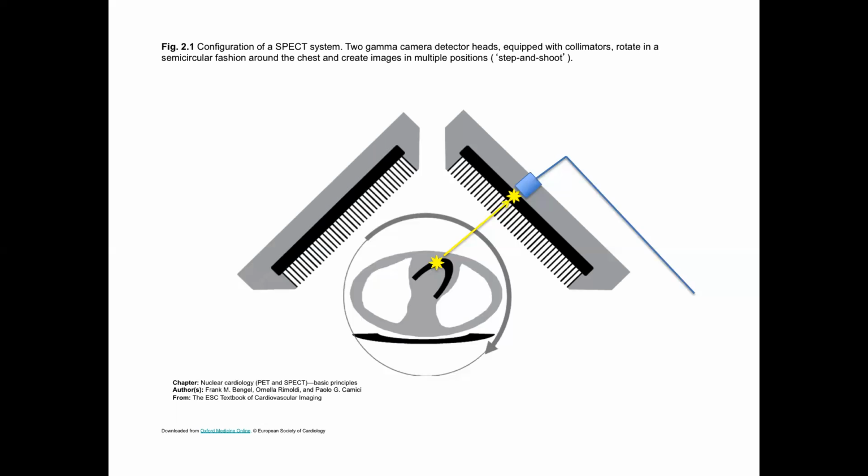For traditional SPECT systems that have sodium iodide crystals here, it takes about 20 minutes to collect all the data, because you have to build up your detection of the counts. And so you'll set this at a certain angle for a minute or some short time, then click, do the next one, click, do the next one, and you get through to build up a set of projections.